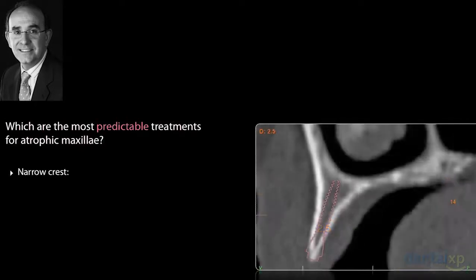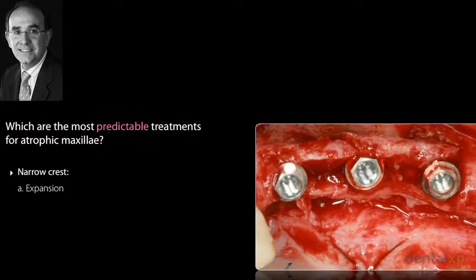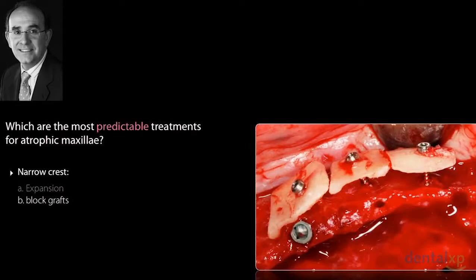I love to talk about the narrow implant, because in many of these cases, using narrow implants is a great opportunity to offer the patient immediate loading and to place fixed teeth on the same day of the surgery. But at the same time, many times in the neighboring area I do a split crest, I increase the volume, I improve the lip support, and in many other cases, at the same time, I use a block graft with a Fouad Khoury approach to obtain horizontal bone growth.